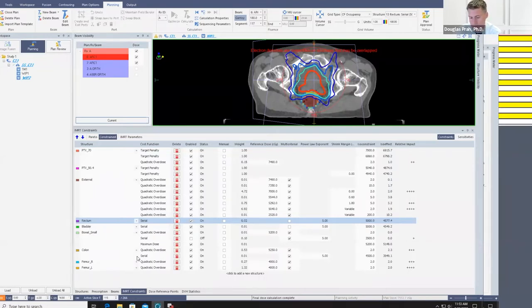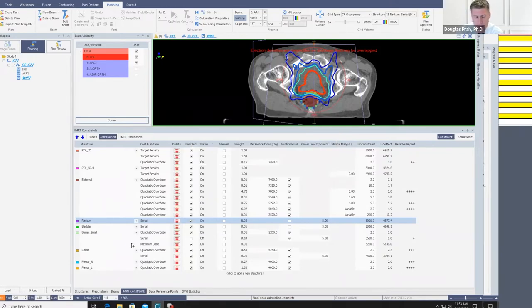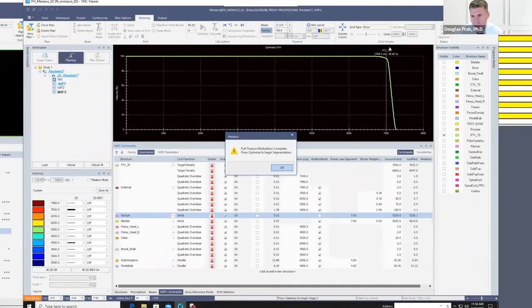If I'm concerned with DVH points, let's say in the lungs, in a thoracic patient, I will use parallel structures and I might use multiple parallel. Like the V20, I'll put a parallel in, V20 less than 20 or 30, whatever it might be, and a V5 less than 50%. I'll have two separate parallel functions that I'll enter. So I probably use parallel more than serial when I'm trying to control DVH points on a curve. And it does a relatively good job at that. So here you go. It was kind of driving me crazy here, the difference between my DVH stats.